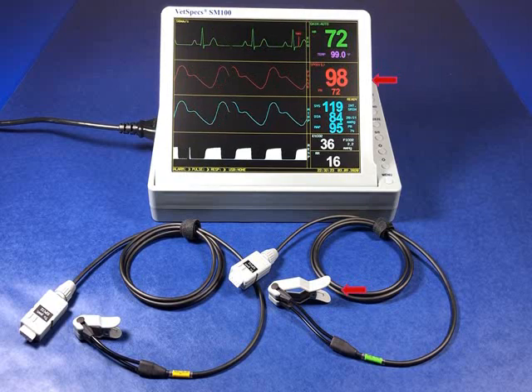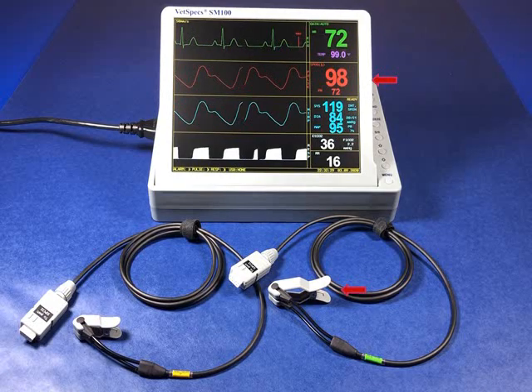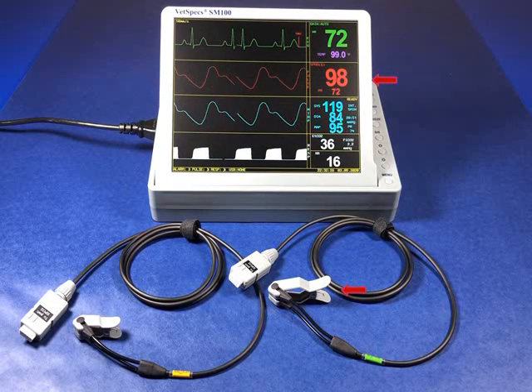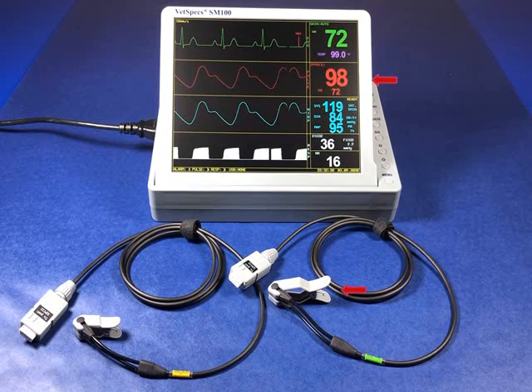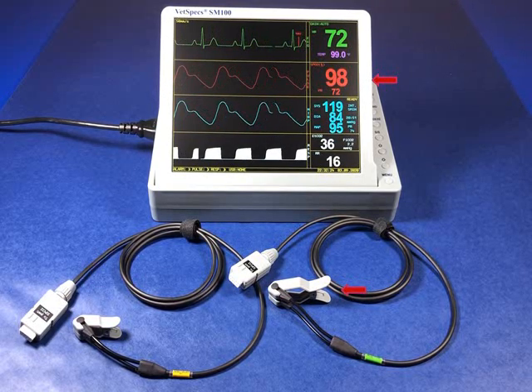Different from all other pulse oximetry sensors in the industry, our leg paw sensor has been outfitted with an infrared light source which is approximately 30% stronger than that found in our own lingual sensor. It is this increased light intensity which enables our leg paw sensor to register accurate values from areas such as the Achilles tendon on medium to large patients, or over the entire paw of smaller cats and dogs, including those with moderately dark fur or pigmentation.